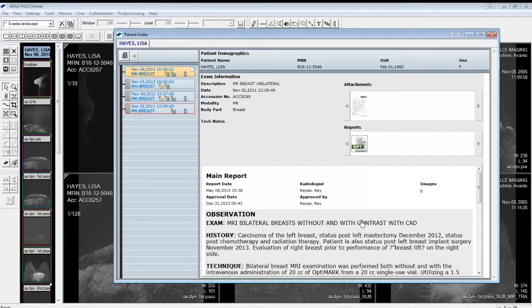When using the patient folder in the full diagnostic viewer, it should be noted that the window is persistent, meaning the viewer will remember the size and location of where it was last opened. One of the main benefits of the patient folder is the ability it provides the user to open prior studies without going back to the work list.